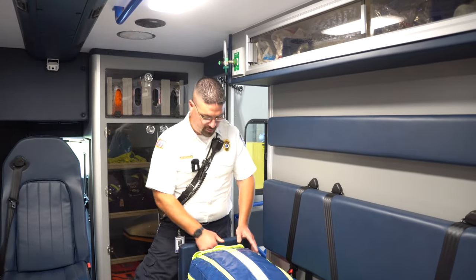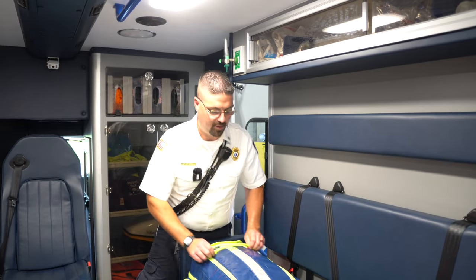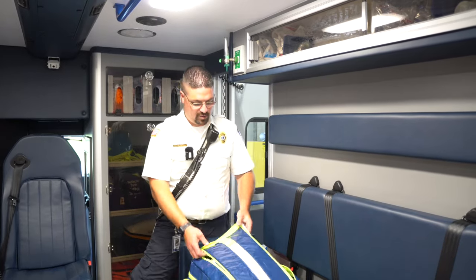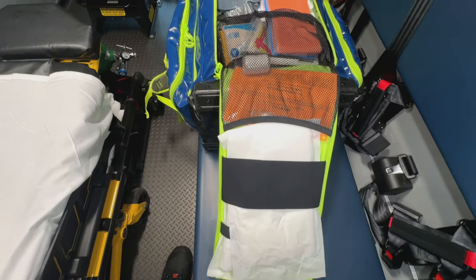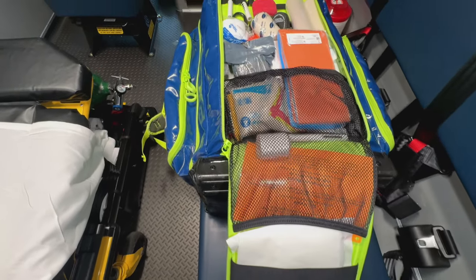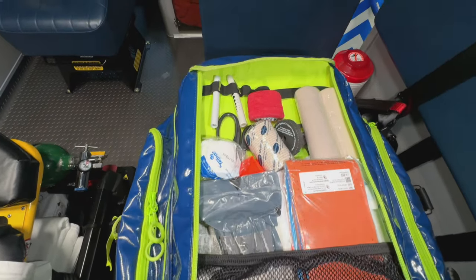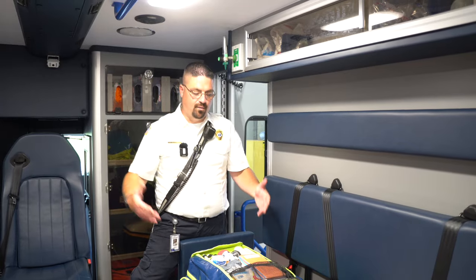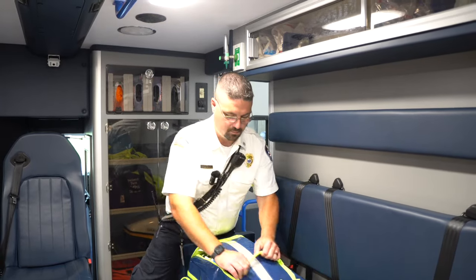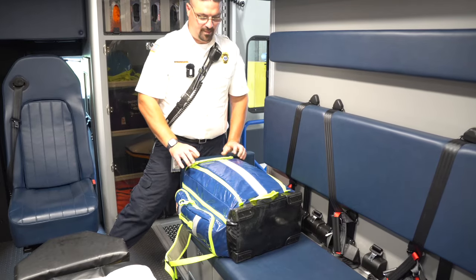On the front of the unit we also have the trauma supplies: different size dressings from small to large, splints, tourniquets, and wound control materials to stabilize and get patients out to the ambulance. This is the bag you take in on pretty much every call until proven otherwise.